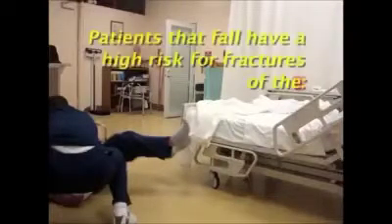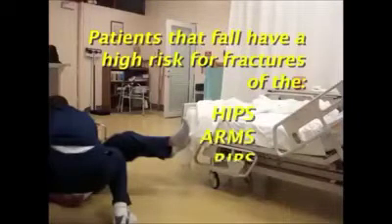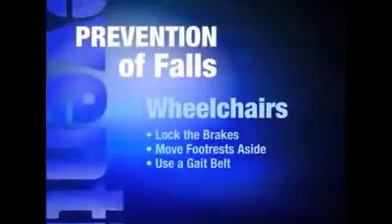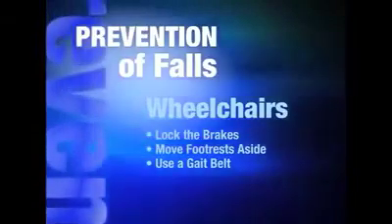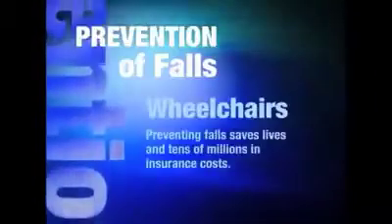Serious injuries could be the result of falls caused by rollaway wheelchairs. Patients that fall have a high risk for fractures of the hips, arms, ribs, or skull. Before transferring a patient to a stretcher or wheelchair, make sure that you have the wheels locked and the footrests are cleared and out of the way to prevent falls.